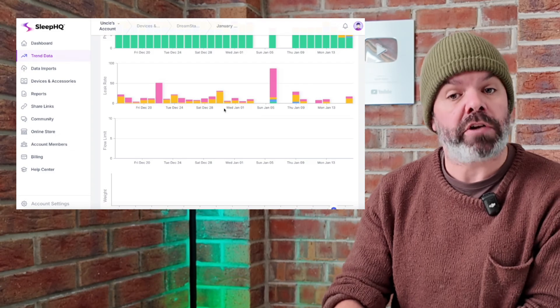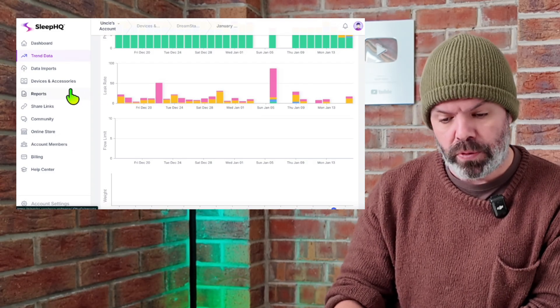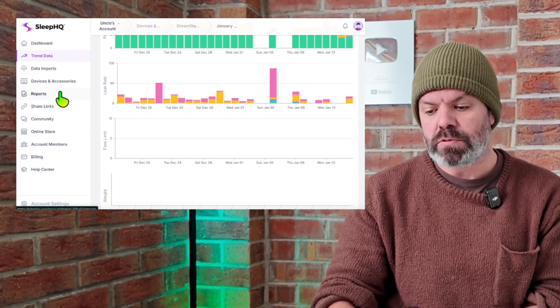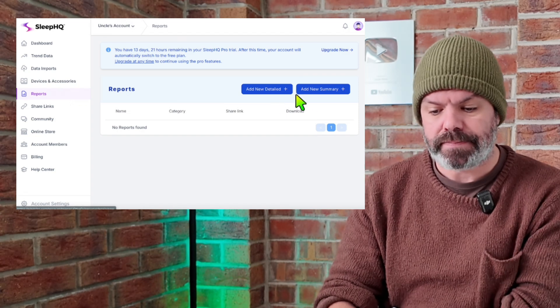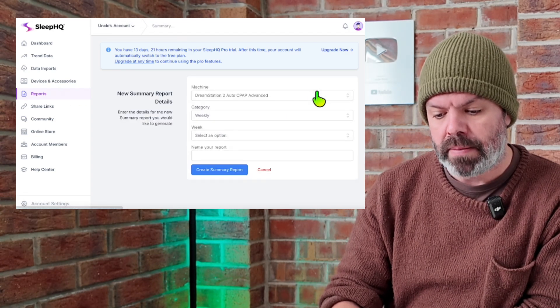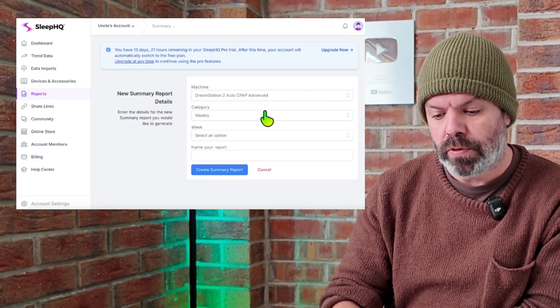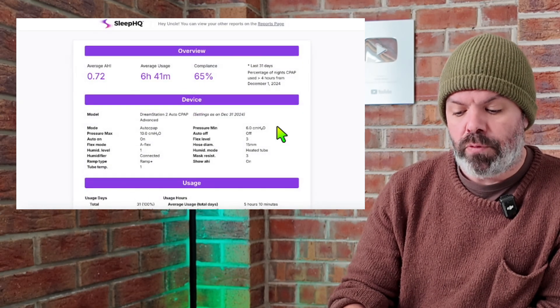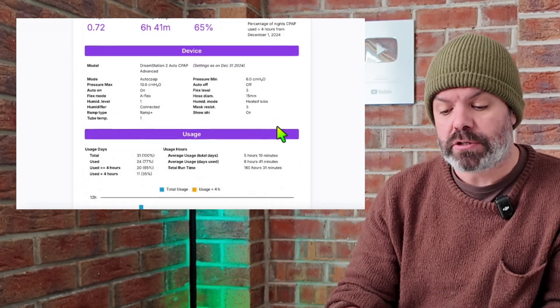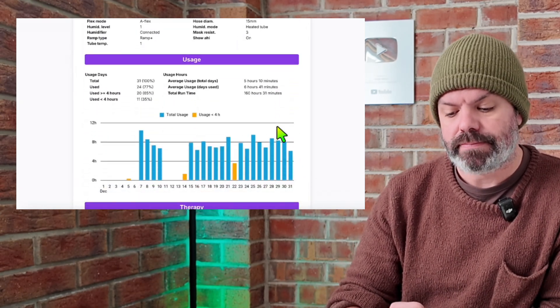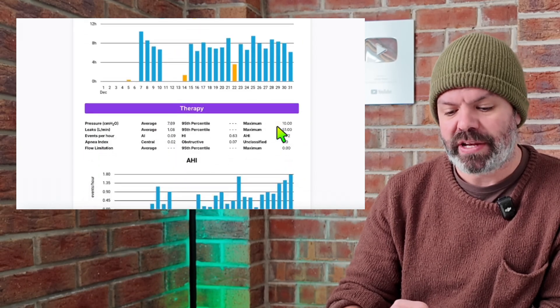And if you like, you can also generate reports. So we'll quickly generate a report here. We'll just do a summary report today and we'll do a monthly report. And there's our report, which we can print off, download, send to a healthcare professional, whatever you need to.